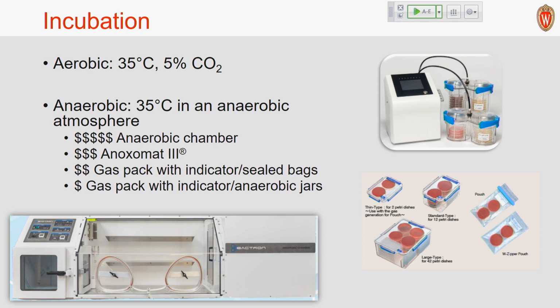So now what we do is for our primary plating, we use the PRAS media, and we use individual packets. And then for our subculturing activities, we tend to just use the regular anaerobic media. Our feeling there is that, out of the clinical material, you may only have a few organisms. You want to really optimize your recovery. So that's why I use PRAS, and then we get it right into these things. The other nice thing about this is that you can take them out and read them right through without having to open them up. You just flip it over and look and see if there's anything growing, and then you open it up.